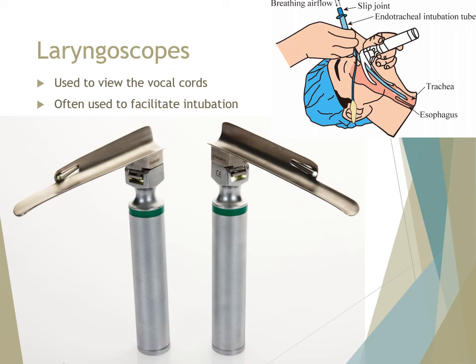The laryngoscope is used to help insert tubes. We also do this in surgery, especially for those who have inhaled anesthesia, like with the Boyle's machine. Since it's gases, it has to go straight to the lungs, so you need to insert a tube into the lungs. So we use the laryngoscope. This one has a battery. When you snap it, a light source comes out and allows you to see. So it's a special field as well. Anesthesiologists are very good at doing that, but internists can easily do this as well.